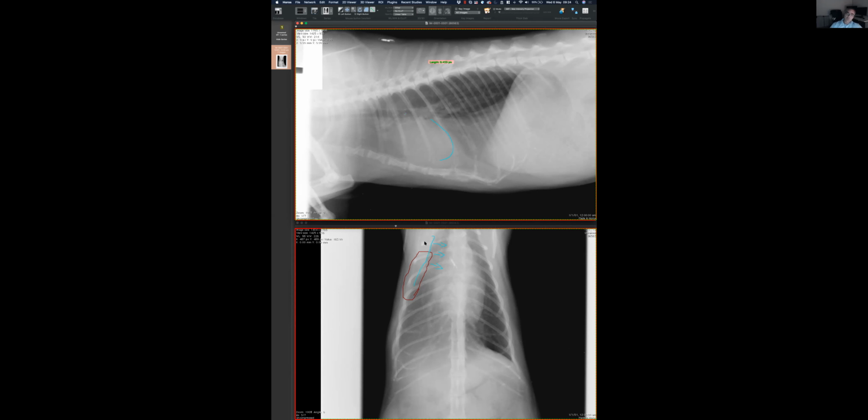So this increased opacity here, where is it located? Well, that would be outside of the lung tissue. I like that. Yeah, that's perfect. Now you're using that feature. This separation of the lung from the wall is actually a feature of pleural disease. Okay, cool. Makes sense?